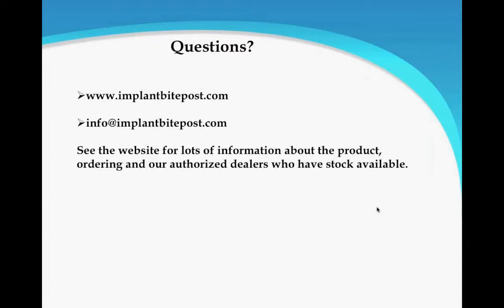So with that, I'll let Dean answer any questions you've sent in. Yeah, I have. The first question, which is a really good one: are they reusable? Absolutely, they're reusable. They're made out of titanium, so they can be disinfected and used over and over again.